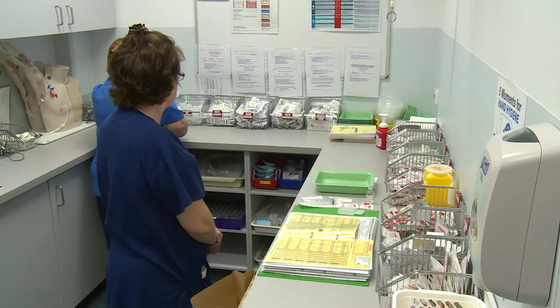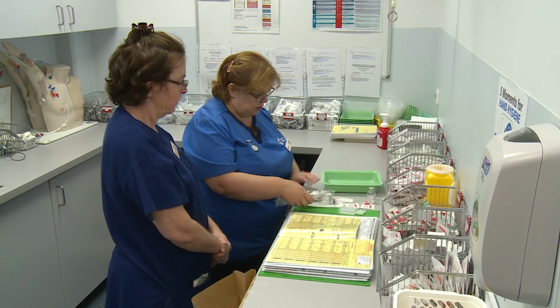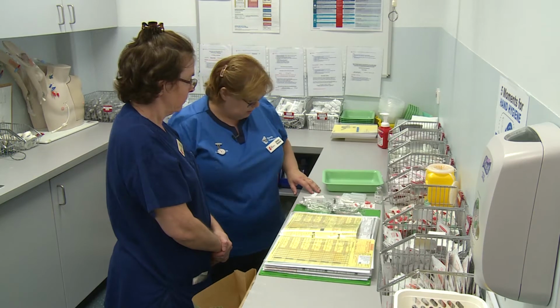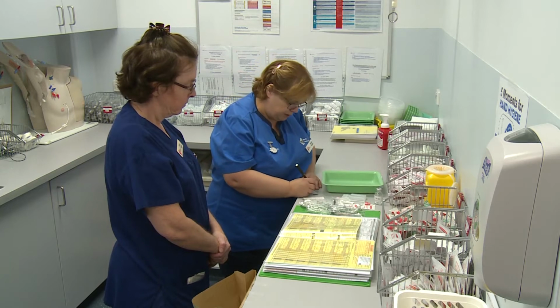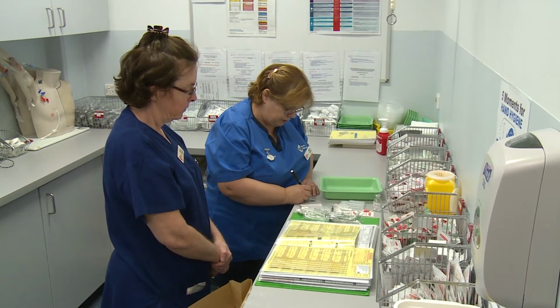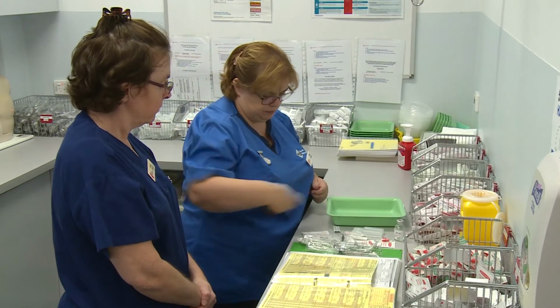Okay, so I need my pre-flush, my post-flush, my label for my syringe, I've got my medication, and I've got my ampules. Right, so I'm just going to label up, write on my label so that I can stick it straight on my syringe as soon as I've drawn it up. So it's amoxicillin, 1 gram, and I'm going to sign it because I'm going to prepare it. Okay, put that in there.